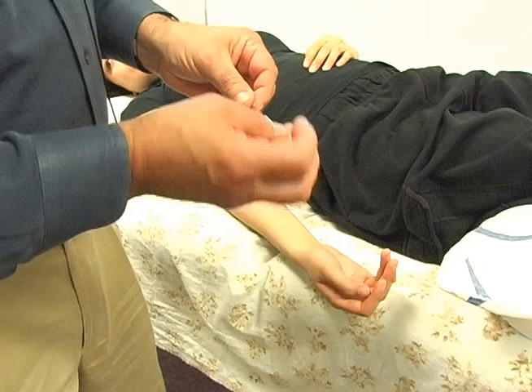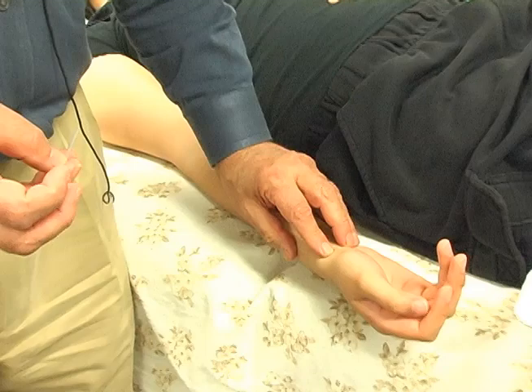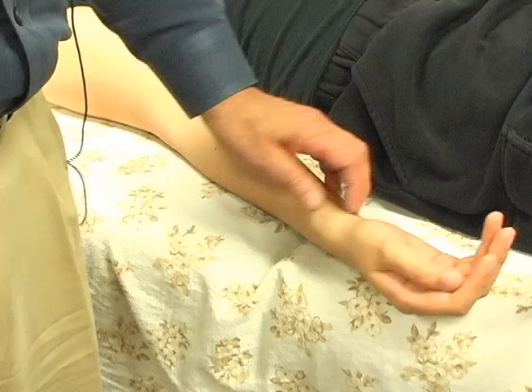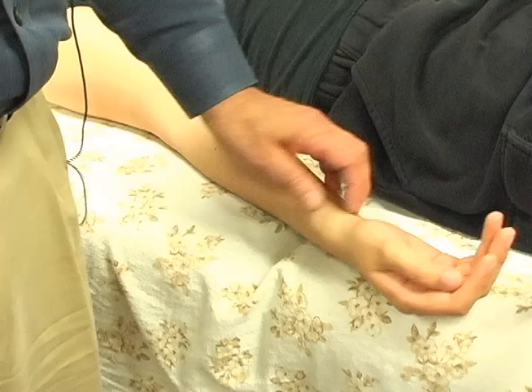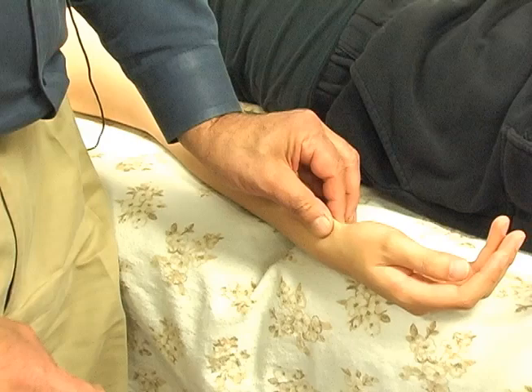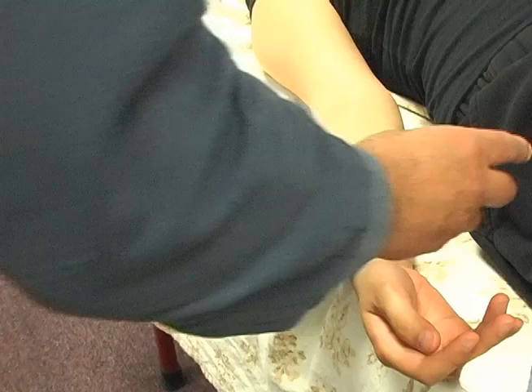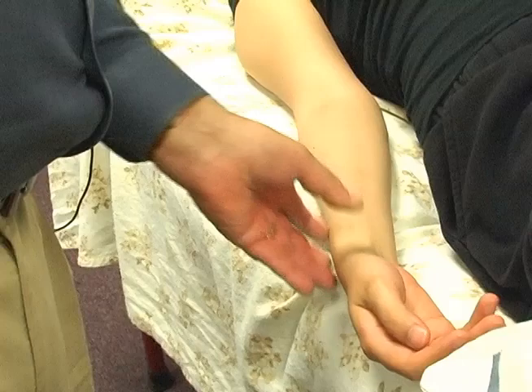I want to tonify lung 9. The channel goes this way, so my tonification is going to be in the direction of the channel. First, I massage the point so that she comes to the point — I want to tonify it. Very rarely do we go straight in; I'm going to pinch the skin and find where the point is. Her point is vortexing a little bit this way. This is called the Oshida hand — it feels the base of the needle and provides support and comfort.